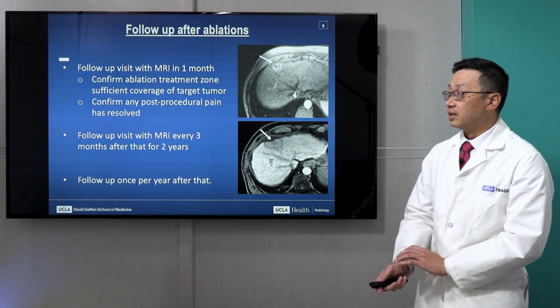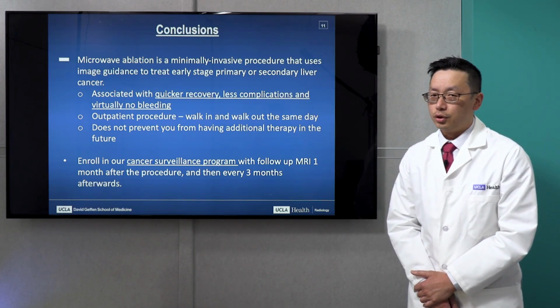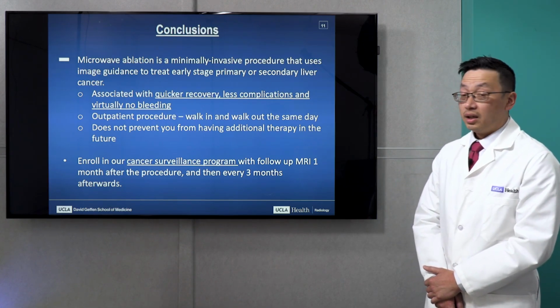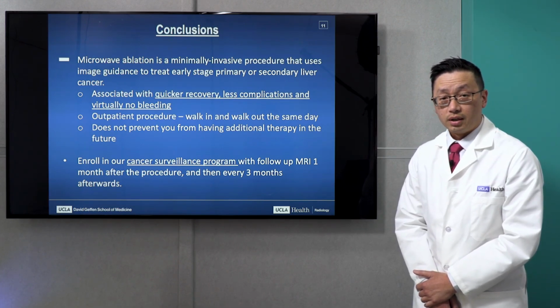that for regular surveillance. So in conclusion, microwave ablation is a minimally invasive, image-guided procedure used to treat early-stage primary and secondary liver cancers. It's associated with a quicker recovery, fewer complications, and virtually no bleeding compared to surgery.